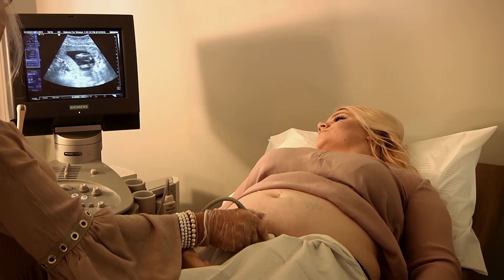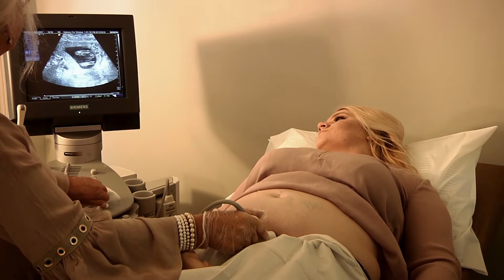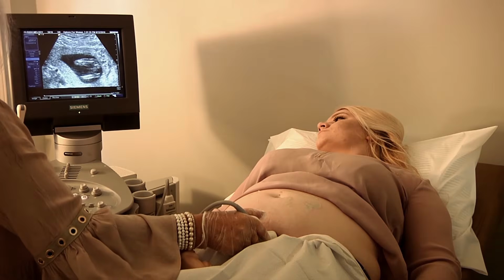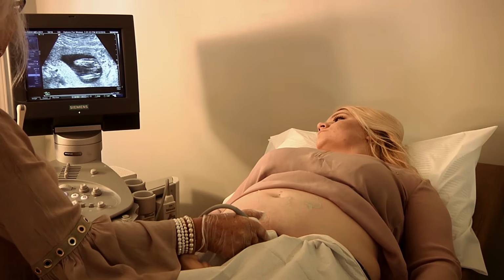And I want to get the whole femur. And then I'm going to zoom in on it. And then measure. And you want to get the whole bone in.